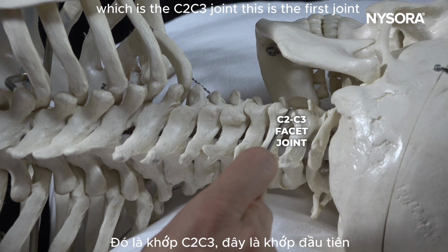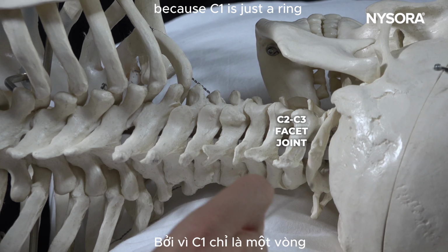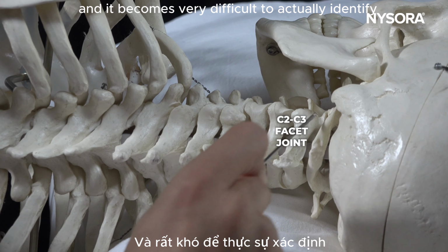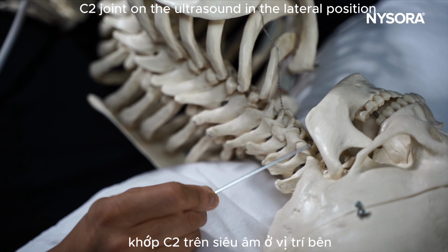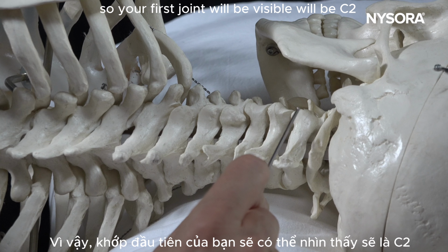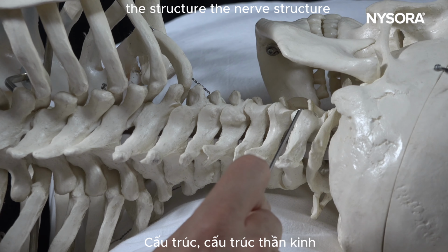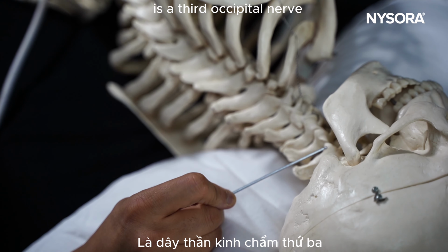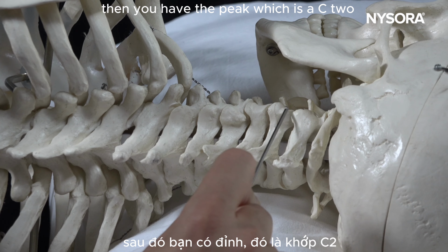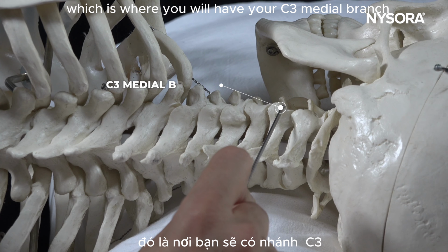This is the first joint that will be visible on the ultrasound because C1 is just a ring and it becomes very difficult to actually identify the C1-C2 joint on the ultrasound in the lateral position. So your first visible joint will be the C2-C3 joint. The nerve structure located superior to the C2-C3 joint is the third occipital nerve. Then you have the peak, which is the C2-C3 joint, and you have a trough, which is where you will have your C3 medial branch.